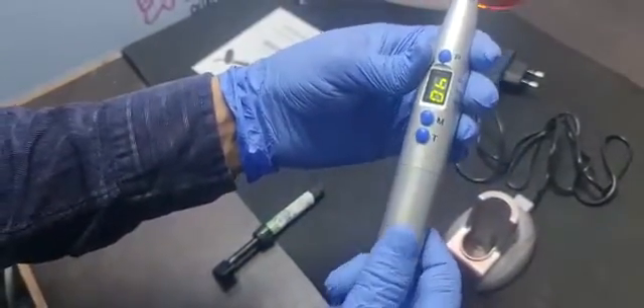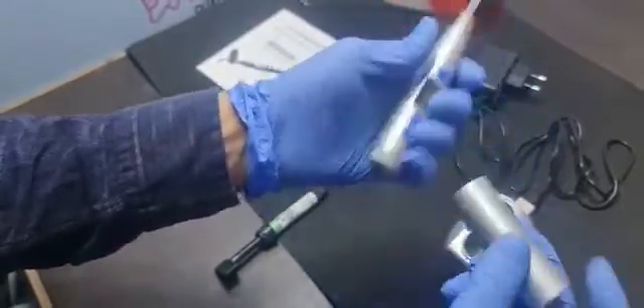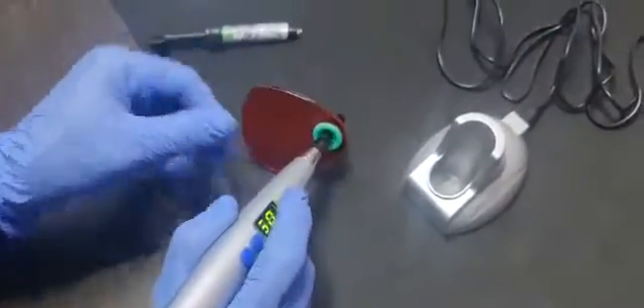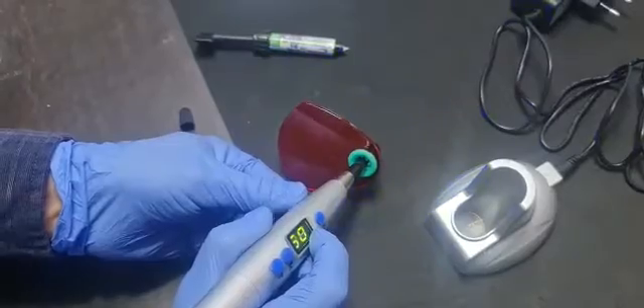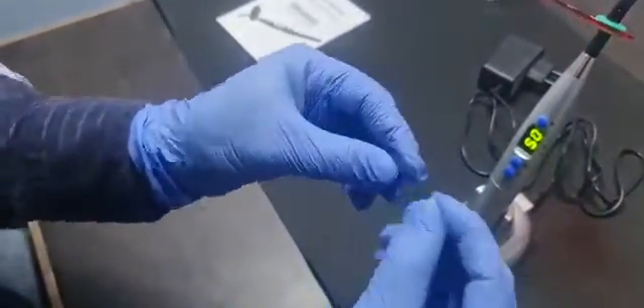The battery is 3.7 volt and 2200 mAh, and it is easy to change. In the 5-second curing mode, you can check that the material is very hard.